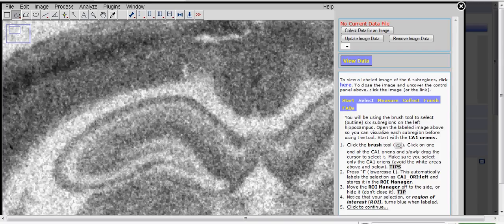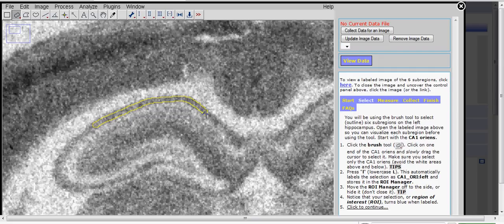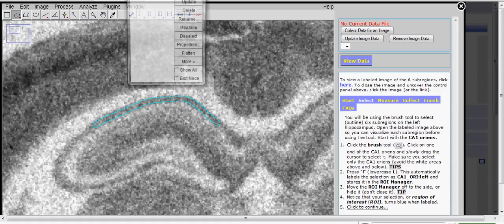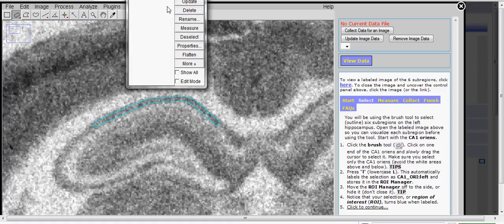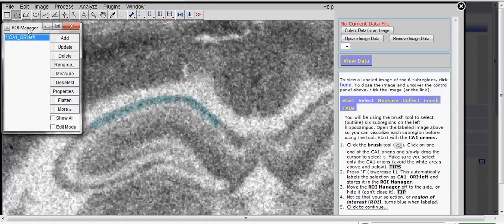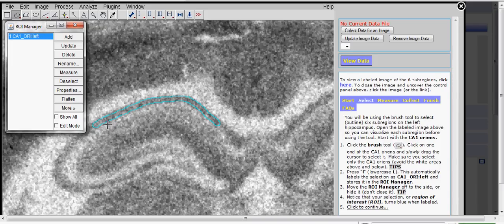The first region is the CA1 Oriens. So you click and drag to select the whole region. When you let go, you can click L, another macro that labels this selection. You'll see a new window up here called the ROI Manager. That first region of interest that you selected is listed there. You'll also notice that the region you selected has turned blue instead of yellow. That way you know it's been labeled already and it's been stored in this window until you're ready to measure all this at once.